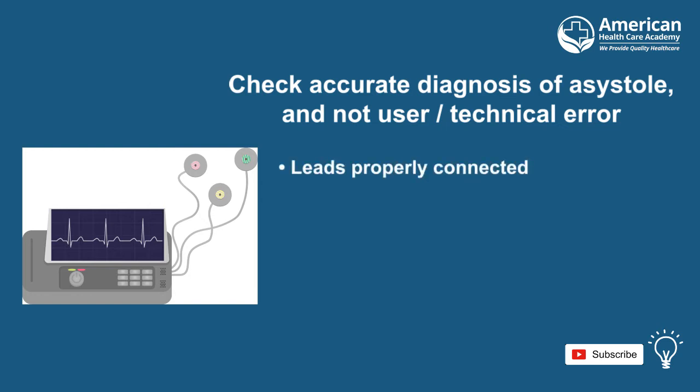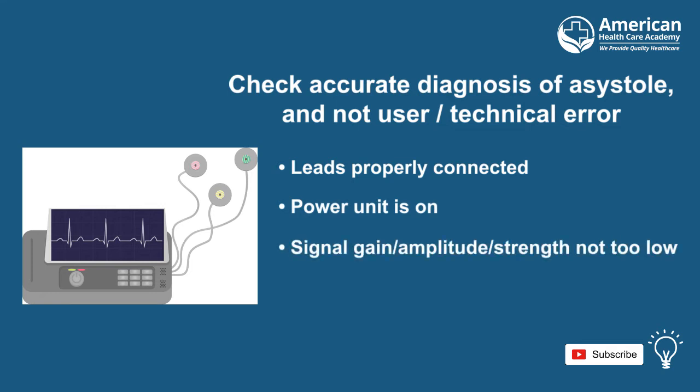Be sure that the leads are properly connected. Check that the power unit is on. Make sure that the signal, gain, amplitude, or strength is not turned down or too low. Be sure that the rhythm doesn't look like another pattern.